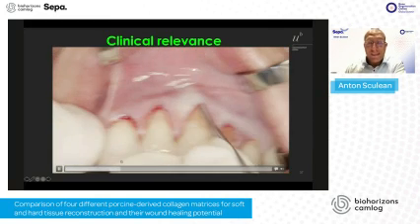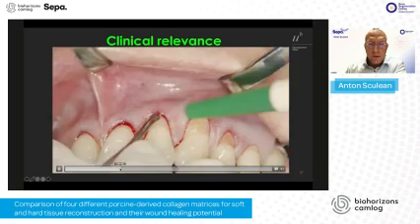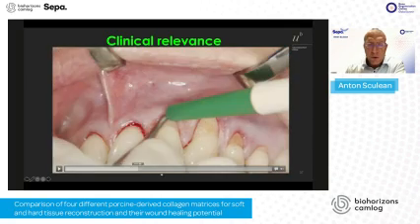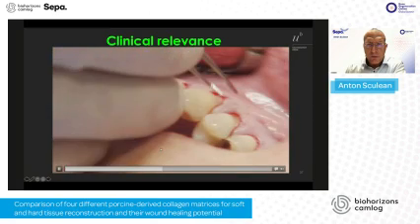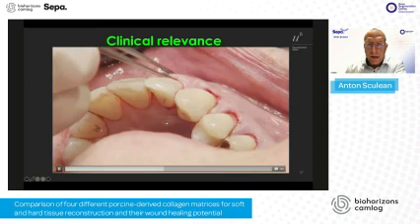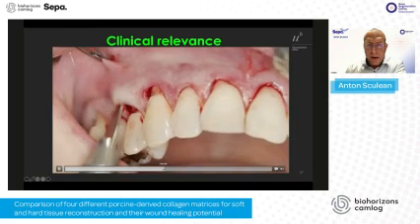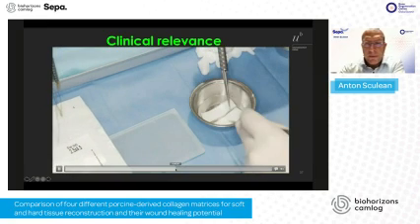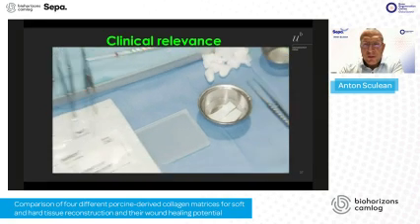This was a quite extensive surgery. It was a young lady that had this quite extensive soft tissue defect. You see the preparation of the tunnel. I like to use this technique. And then I move, in fact, I just want to show you the technical tricks that I can recommend to you.